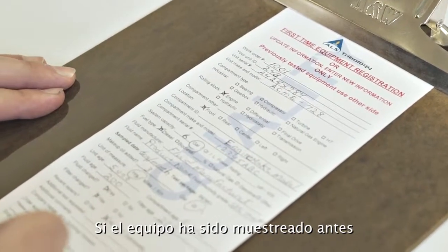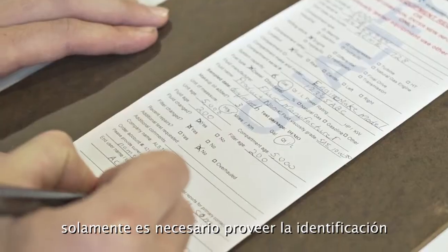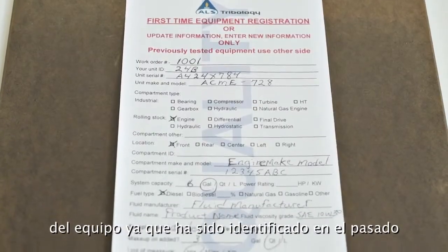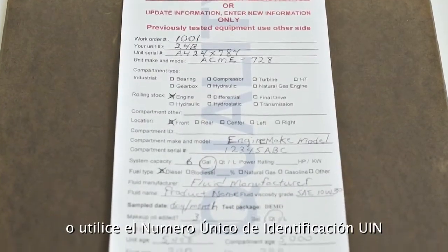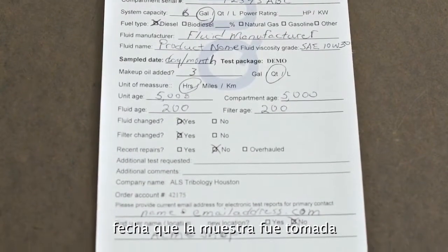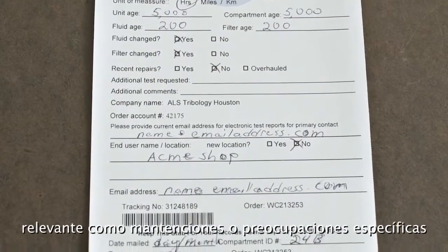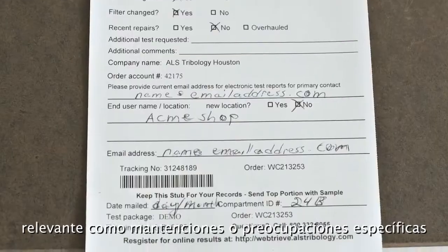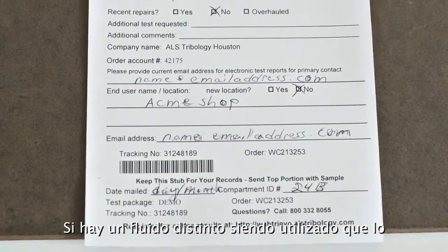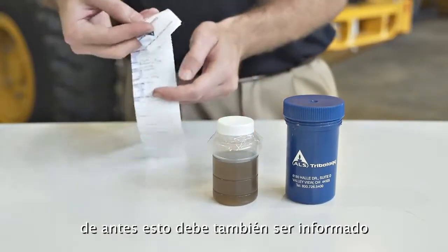If the equipment has been sampled before, it is only necessary to provide the equipment identification as it has been identified in the past, or use the laboratory unique identification number (UIN), age of the lubricant and equipment sampled, date the sample was taken, filter change, and any relevant notes such as maintenance or specific concerns. If there is a different fluid product being used than in the past, this needs to be indicated also.